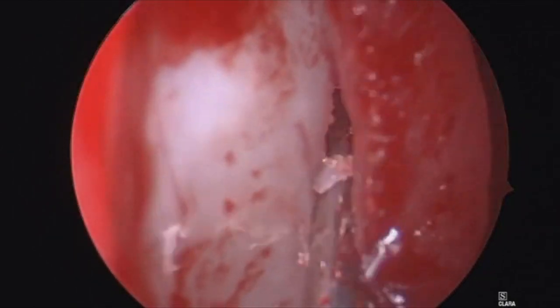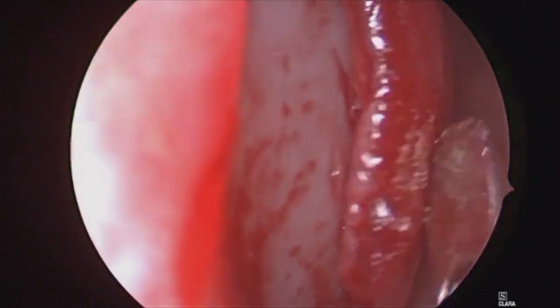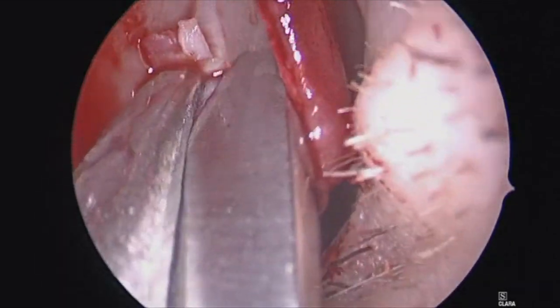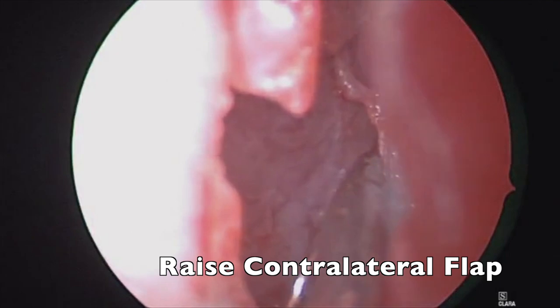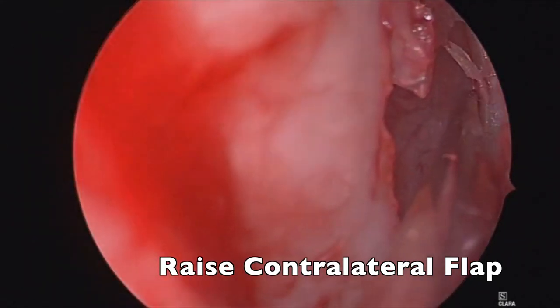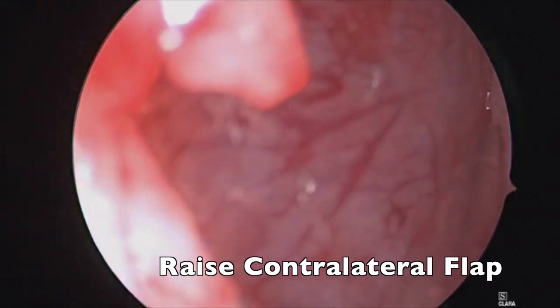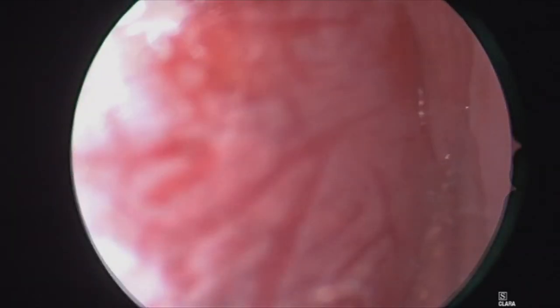Here we are establishing the submucoperichondrial plane on the contralateral side with a suction elevator, and then we're going to take a small window out with an open Janssen-Middleton forceps in order to see that contralateral side a bit better. We'll raise the contralateral flap once again in a submucoperichondrial plane — this is again a nice clean plane, relatively avascular with minimal bleeding, giving us access to the isolated cartilage in order to address it.